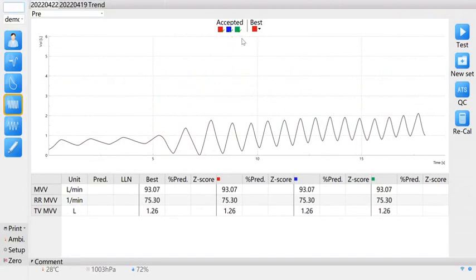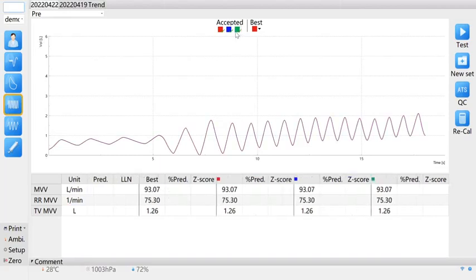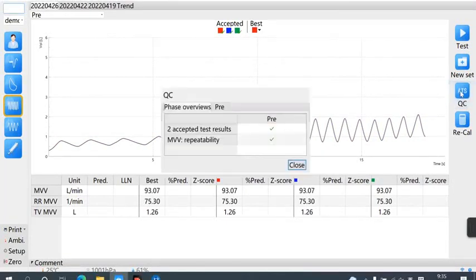The test results will be represented by curves of different colors. Click the mouse to choose whether to accept the results. Click Quality Control and compare the results twice to make corresponding judgment.